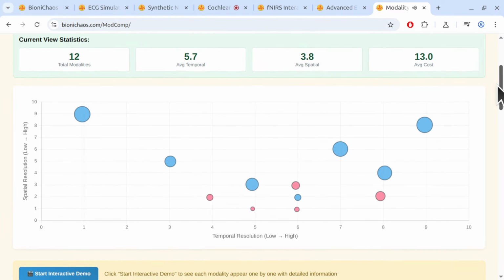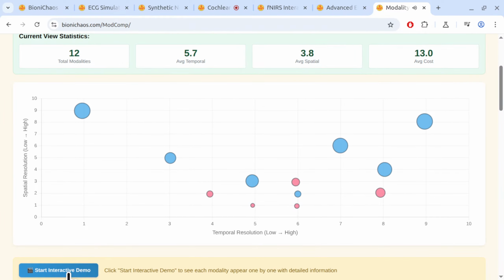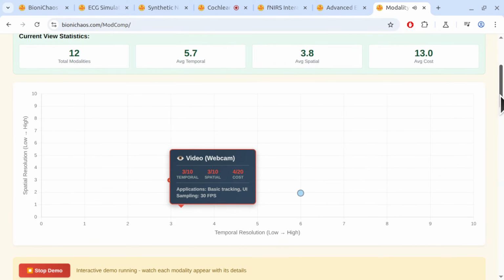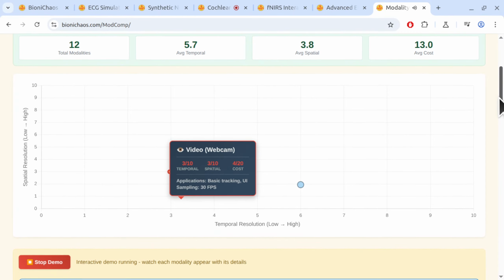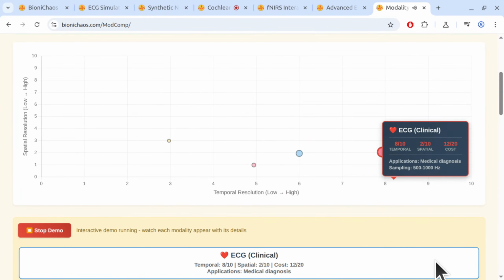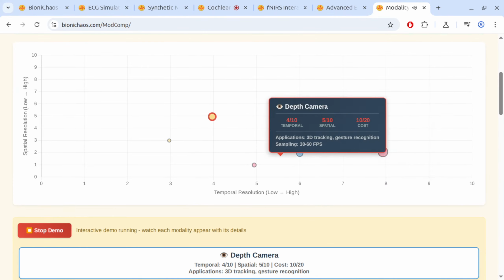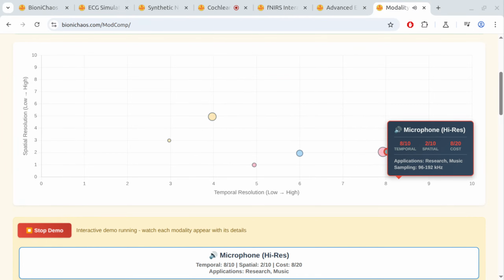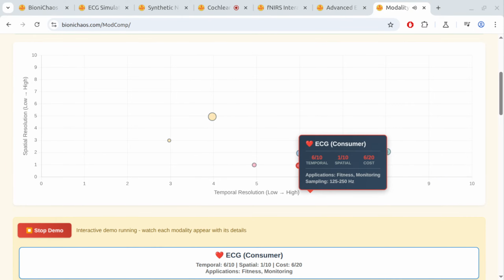We'll be looking at three key things. How fast they capture data, that's temporal resolution. Okay, speed. How detailed their view is, spatial resolution. Got it. Detail. And maybe the most telling part, how much they'll lighten your wallet. The cost. Yes, the cost. Because you very quickly find these surprising trade-offs and sometimes just a delightful irony in picking the right tool.